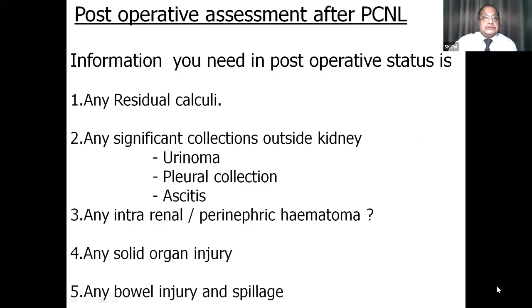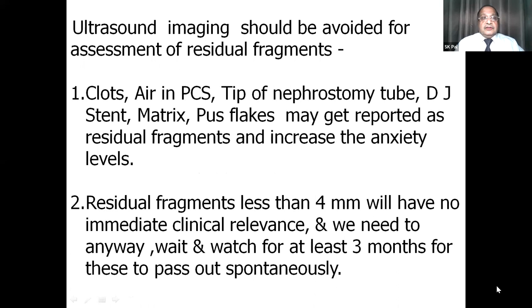Now coming to the imaging modality for the post-operative phase. So in the post-operative stage, what do you want to know? You want to know if there are any residual calculi. You want to know if there is any significant collection outside the kidney like urinoma, pleural collection, ascites, if there is any intrarenal or perinephric hematoma, any solid organ injury if you are suspecting, or any bowel injury and spillage you want to see. So different technologies are helpful for different things.